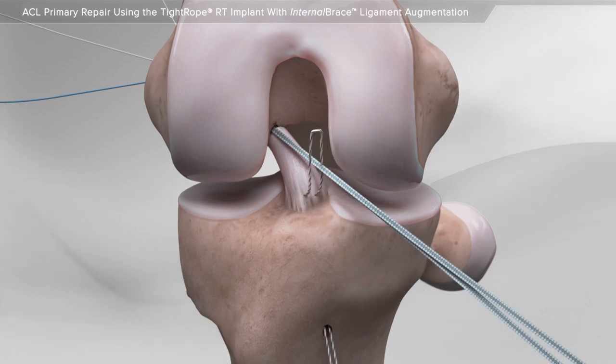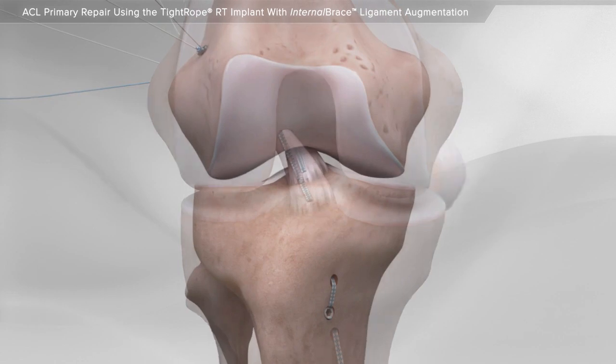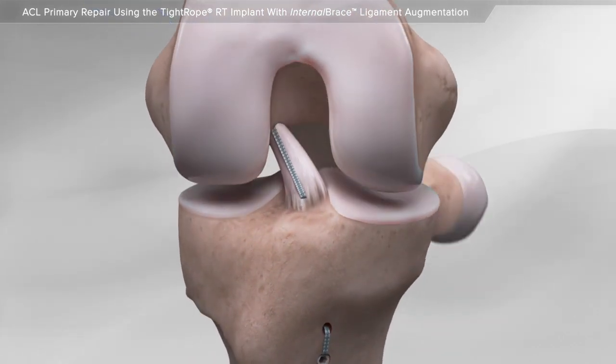Finally, the internal brace suture is passed through the tibia and secured using an additional anchor. This completes the repair of a torn ACL.